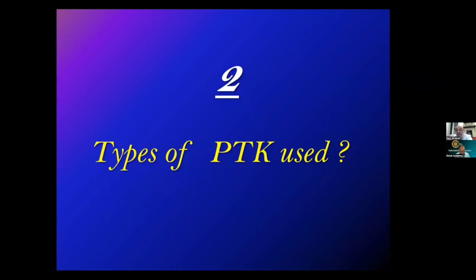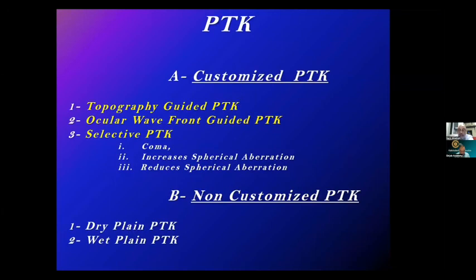Now, what types of PTK? PTK is not just PTK. What types of PTK? PTK is either customized or non-customized.